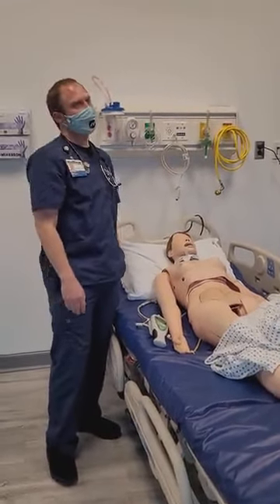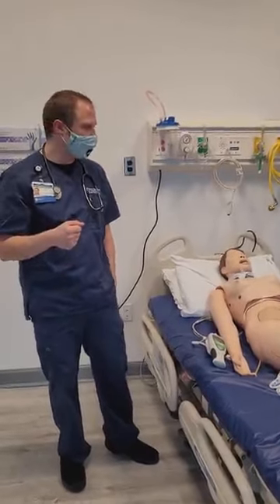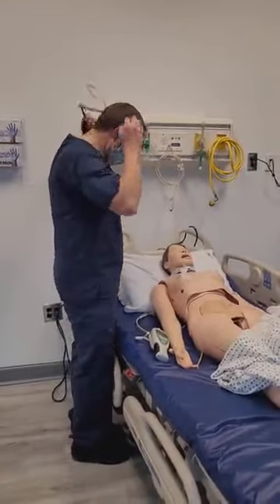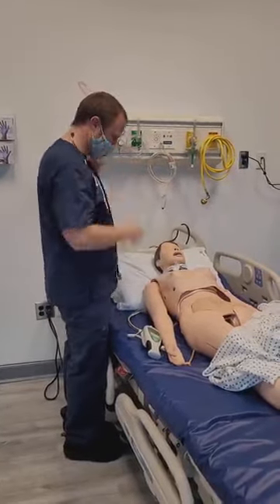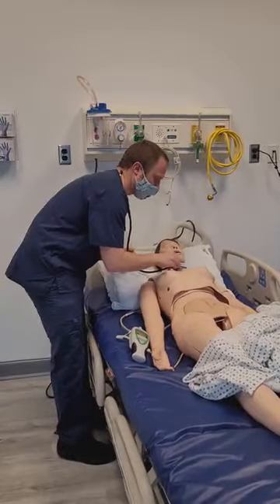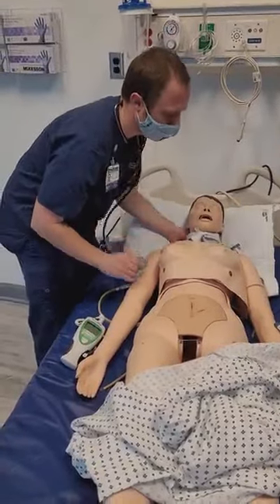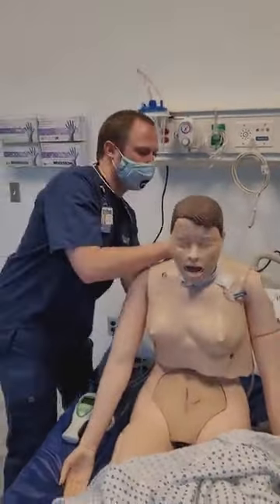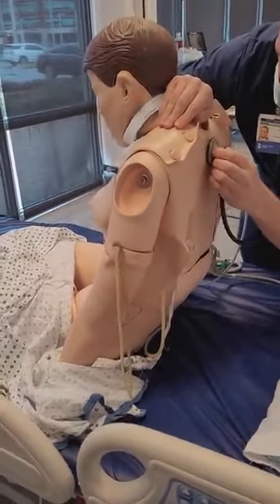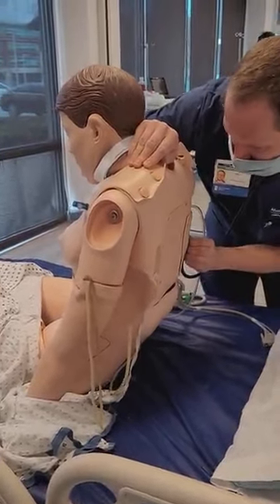For respiratory, I'm listening for resonance: high resonance is air, low resonance is dullness, fluid. I'm going to listen to 5 points in the front here. So I would listen to 1, 2, 3, 4, 5 on the side. And on the back, there are 9 spots I listen to. I'm starting here, 1, 2, all the way down here to 9.